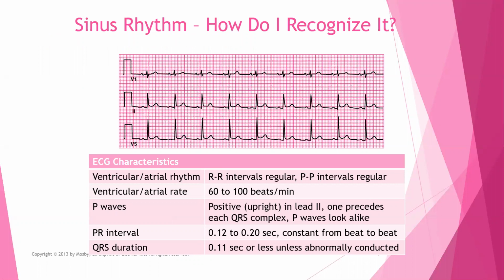Okay, sinus rhythm, how do you recognize it? We're going to go through this systematic approach. If you haven't watched the video on systematic approach, it's important that you take a look at that. But what we see here is sinus rhythm. With just a quick look at this, I can see sinus rhythm about 80 beats a minute with ST segment elevation. And I hope many of you are saying, yep, that's what I see. And maybe some of you are saying, what? But we're going to work our way through all of this.